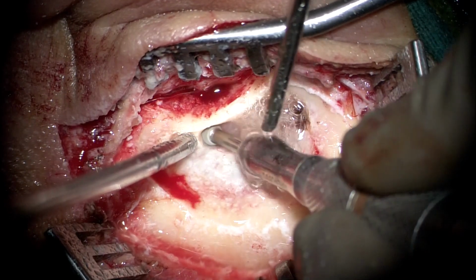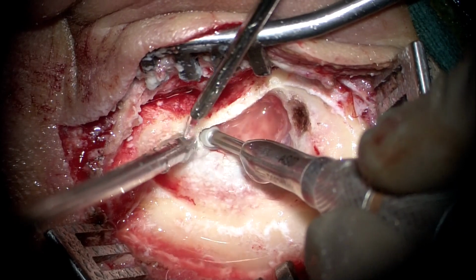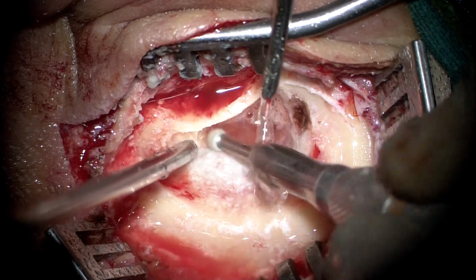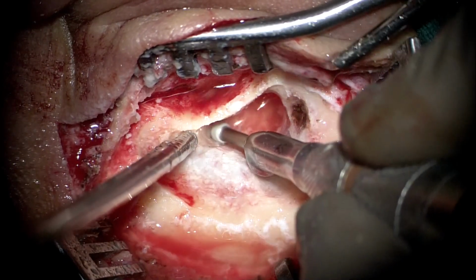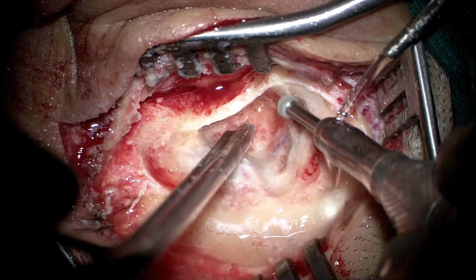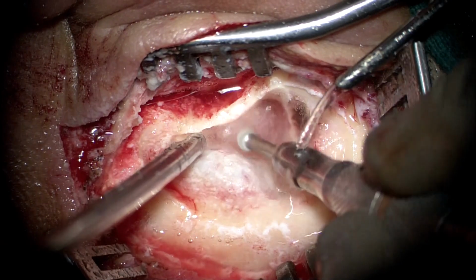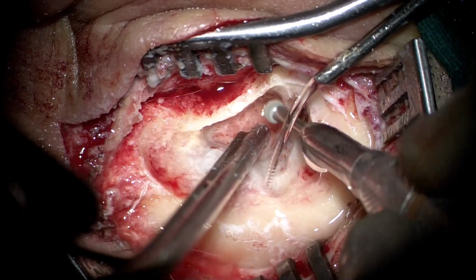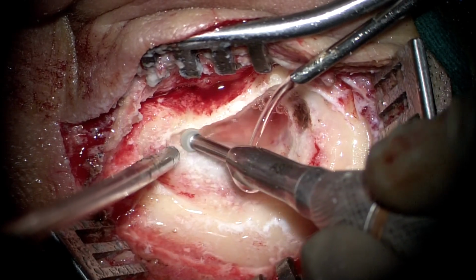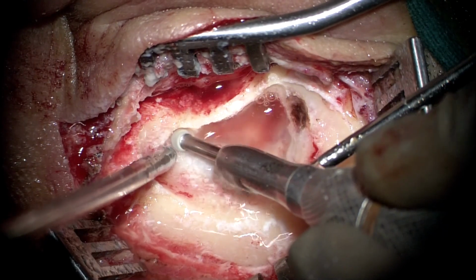So in the same kind of way, we keep increasing the exposure anteriorly, doing the persistent thinning of the posterior canal wall, creating this trough between the sigmoid sinus and the posterior canal wall, increasing exposure there, and at the same time increasing the exposure of the sinodural angle. Doing all these three things together one by one would eventually give us a good exposure. You can see how the shape of the sigmoid sinus now comes into picture, and how it being anteriorly positioned in this sclerosed mastoid is a good enough concern for us if we are to drill down the labyrinth completely.